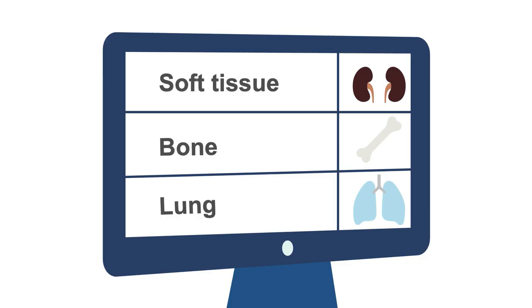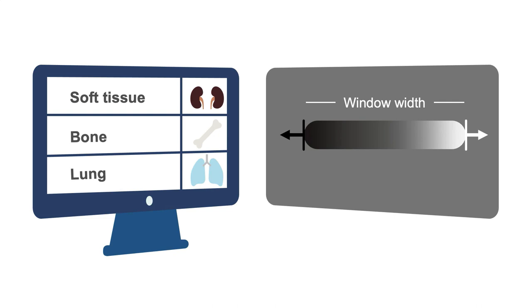In summary, the three most common and useful window settings for your image review are soft tissue, bone, and lung. Each setting has a range of grayscale values it displays called the window width, and a center point called the window level.